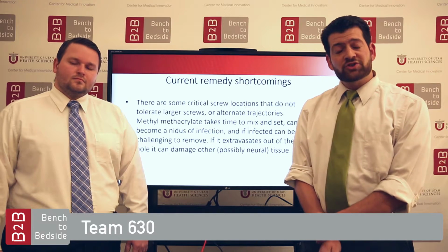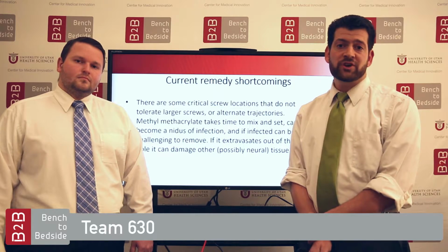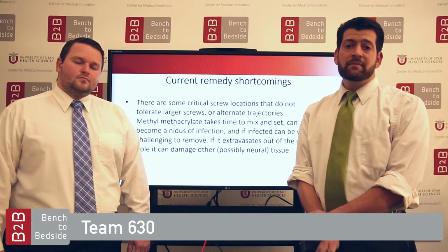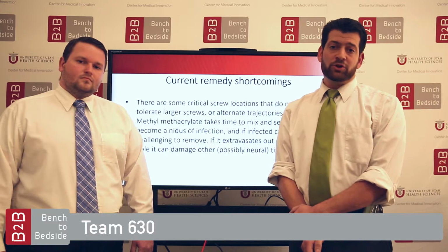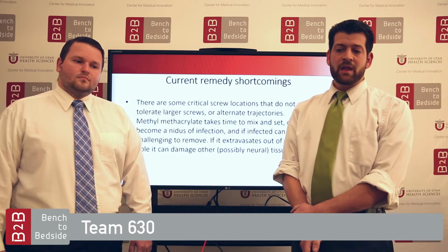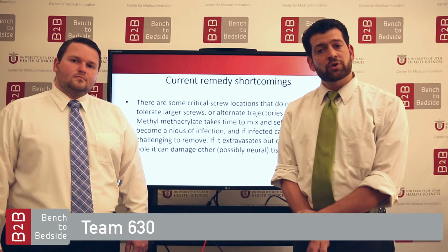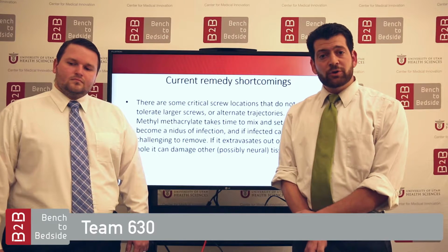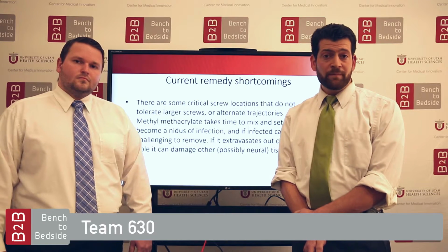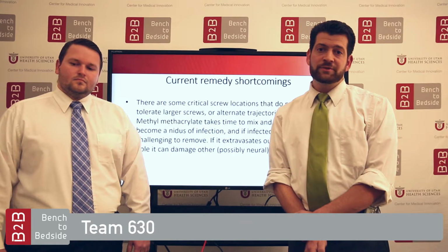Some screw locations are critical and may not tolerate a larger screw or a different trajectory. And injecting methyl methacrylate can be slow. You have to wait for the glue to be mixed and set. Additionally, it can be a nidus for infection. It is never absorbed into the body. And if the glue extravasates out of your screw hole, it can cause damage to adjacent tissues, especially neuro tissues.